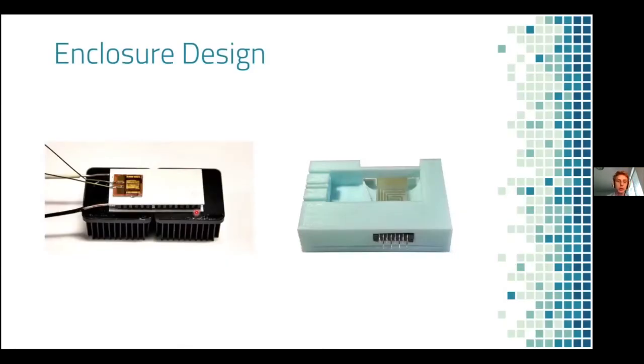So now we move to our enclosure design. We needed to cover the system. So we 3D printed this case, which simply lays on top with a simple adhesive, such as sticky thermal tape. And what this does is this ensures that not only is the system covered, but that the blood chip also has great point of contact with the Peltier.